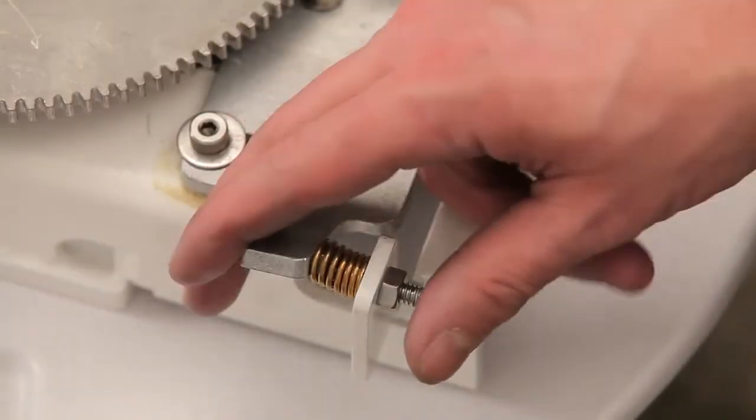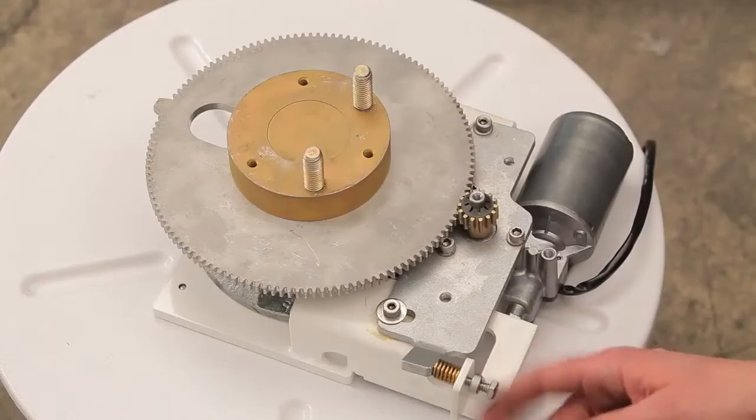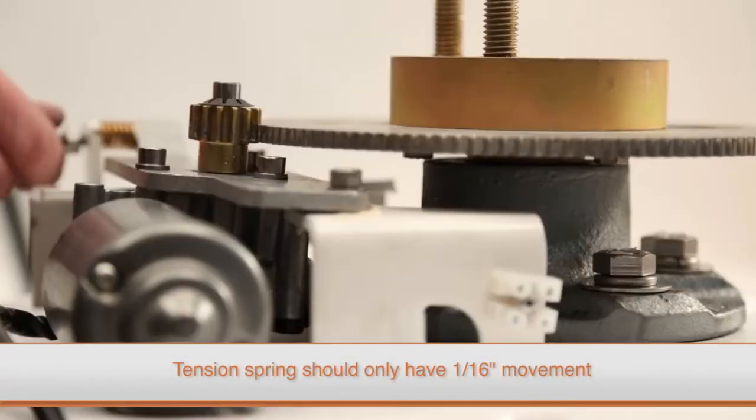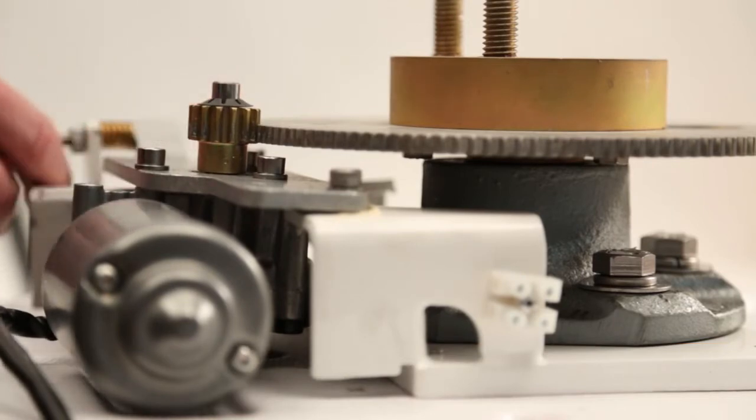Once the tension adjustment bolt is properly adjusted, make sure to tighten the lock nut against the base frame. Tighten the mounting screw only enough so that the mounting plate has 1/16 inch movement, allowing the tension spring to align the gears so that they engage without binding.